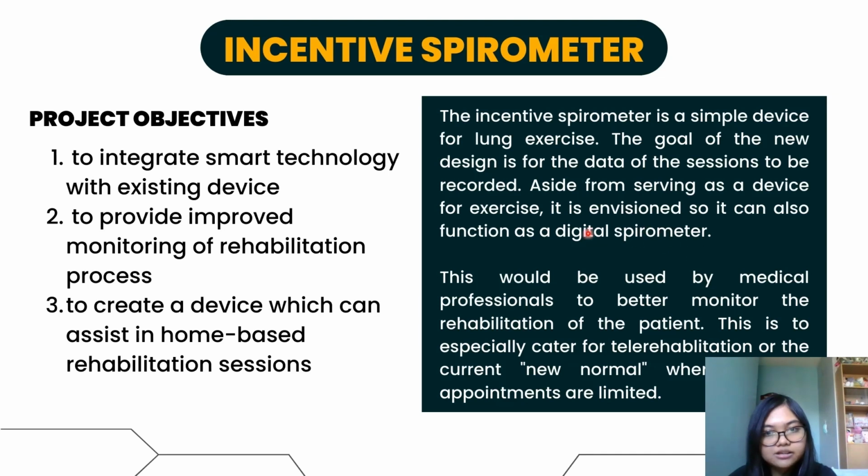As stated here, this could help medical professionals in monitoring their patients and their progress, and it's especially catered to telerehabilitation, or the current new normal where physical appointments are limited.